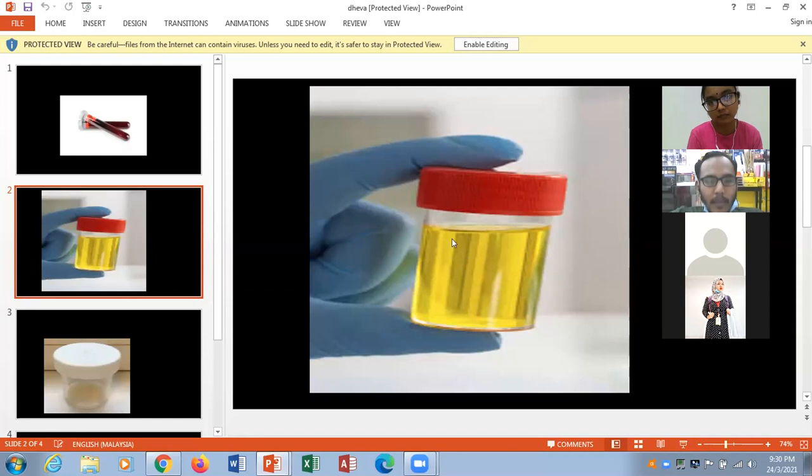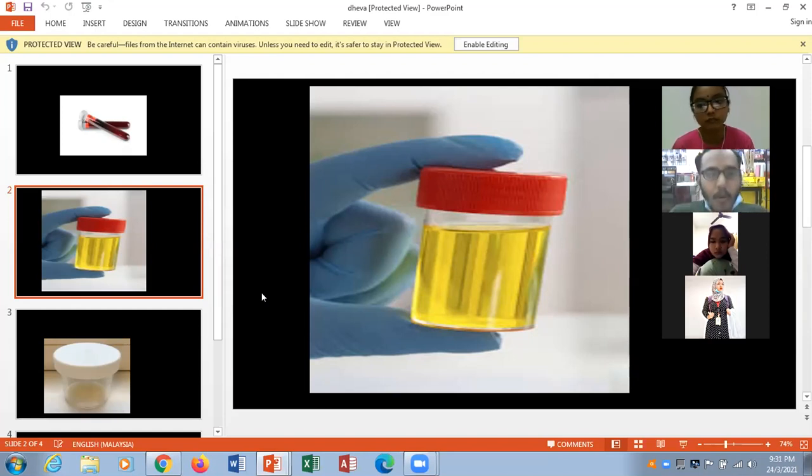Okay, for the urine, it is recommended to use a primary collection container that holds at least 50 ml and has a wide base and an opening of at least 4 cm. The wide base prevents spillage, and a 4 cm opening is an adequate target for urine collection. A 24-hour container should be up to 3 liters. It is recommended to use a sterile collection container for microbiology specimens. The container should have a secure closure to prevent specimen loss and to protect the specimen from contamination. It should be compatible with the automated systems and instruments used in the lab.